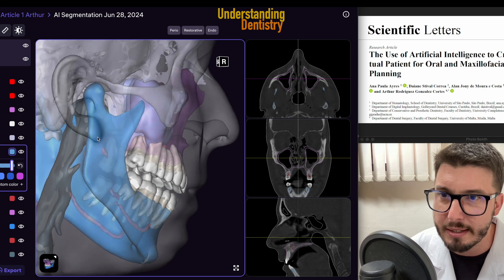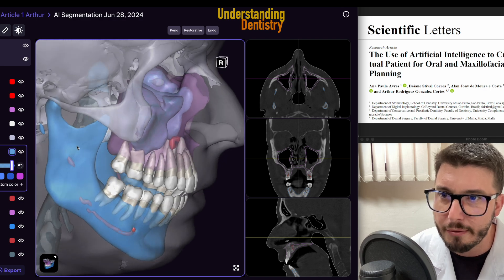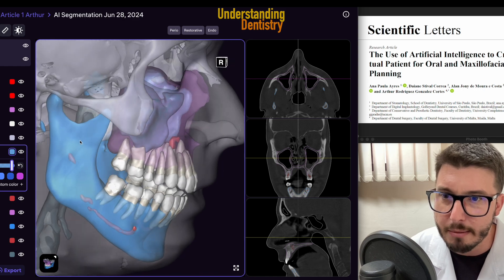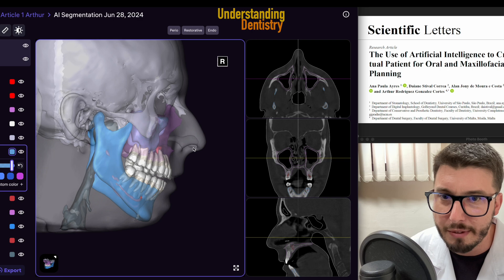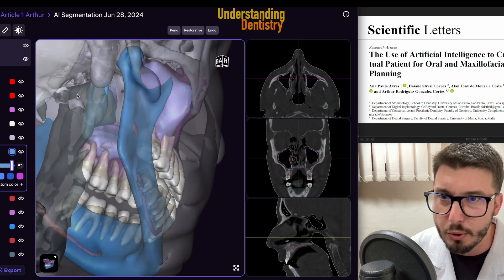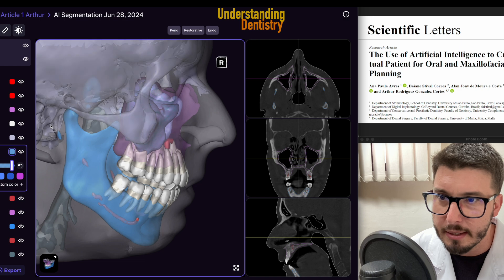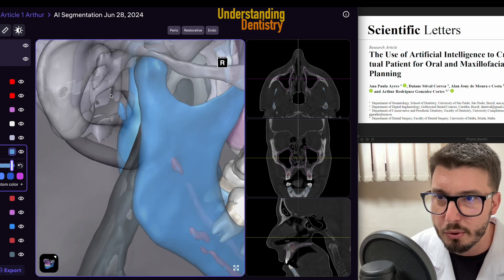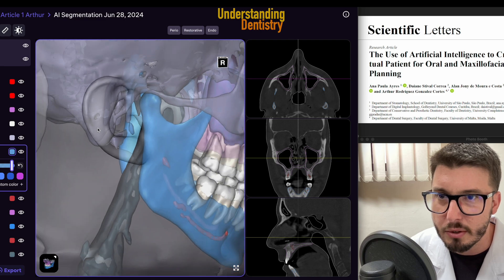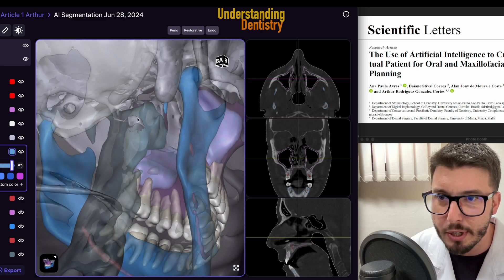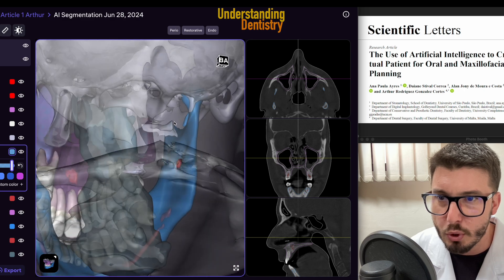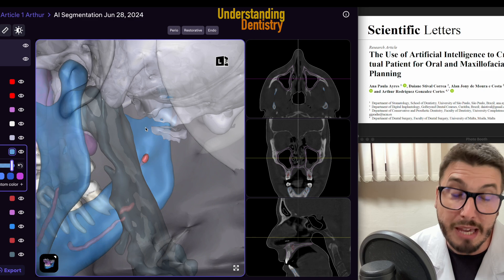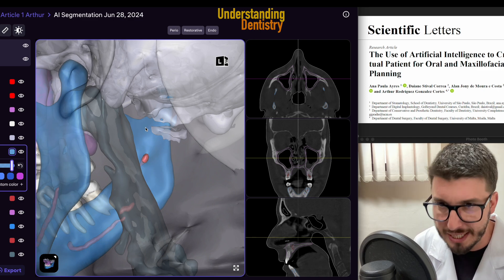We can even see the TMJ — the articular fossa, articular eminence, zygomatic bone here. There's even space from the nose, mastoid process, and the styloid process right here. That's a big CBCT for a different purpose, but usually you won't have all this field of view because this may involve unnecessary radiation for the patient, unless it's actually needed — so it depends on the clinical situation.